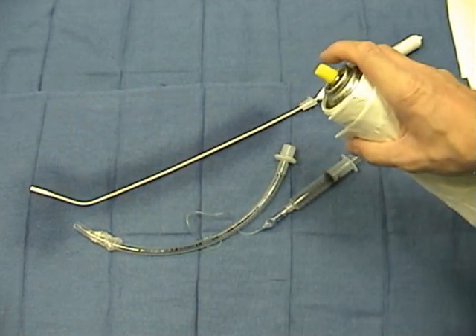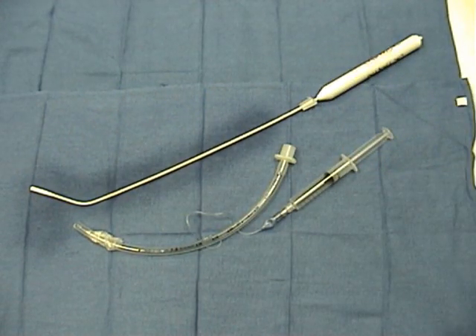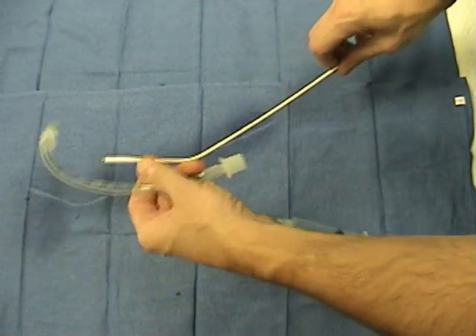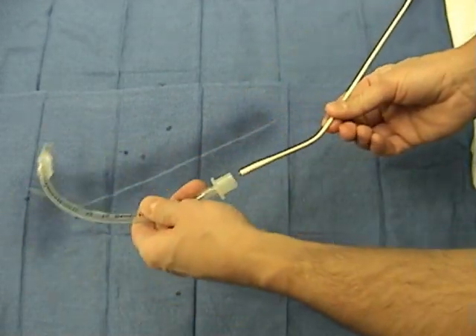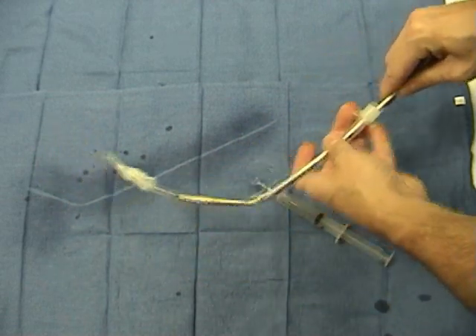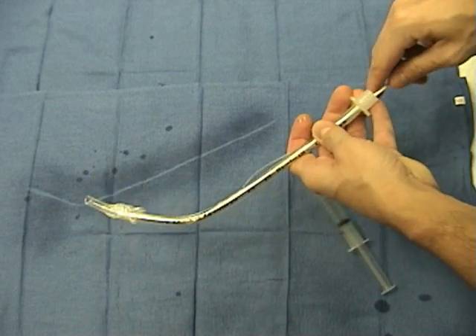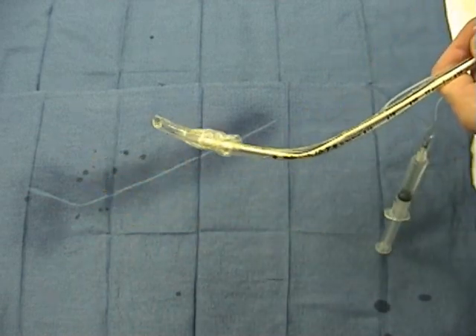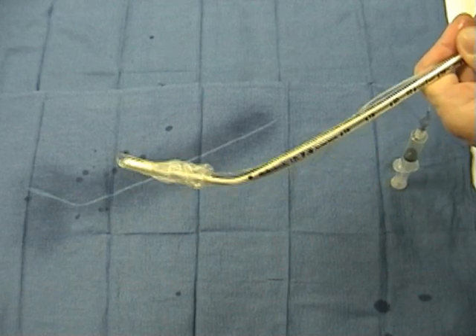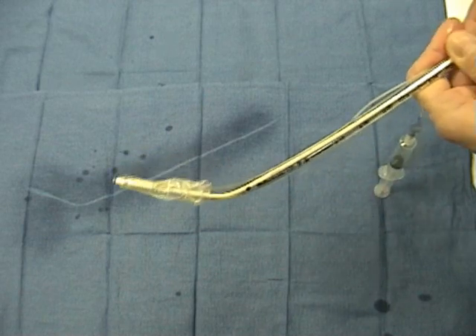An important issue is to keep the stylet very well lubricated. I prefer non-water-soluble lubricants so they don't dry up. Once we place the lighted stylet through the endotracheal tube, be careful enough to allow the tip of the lighted stylet only to protrude a few millimeters — a quarter of an inch or so.